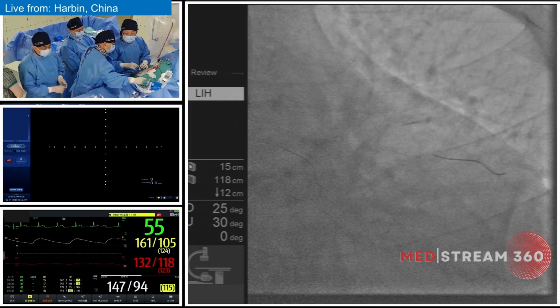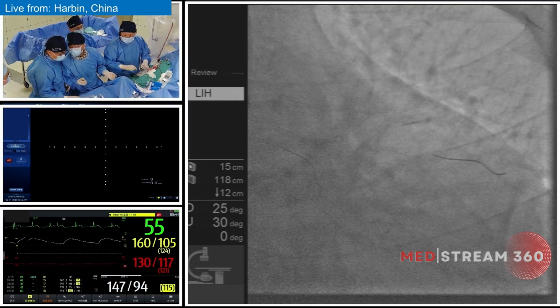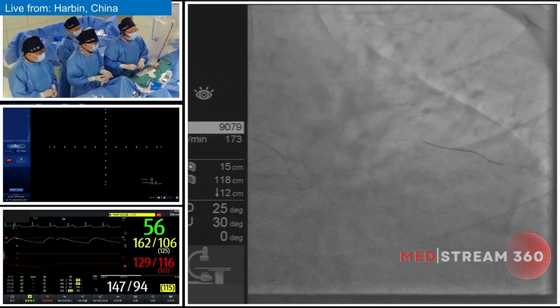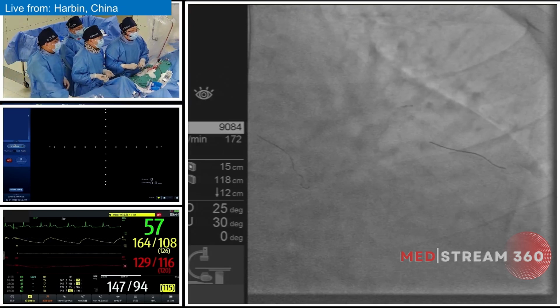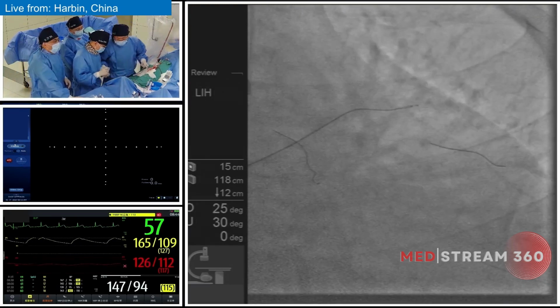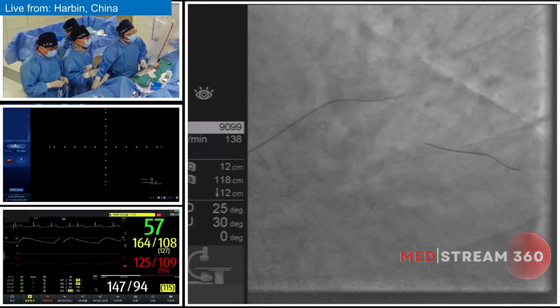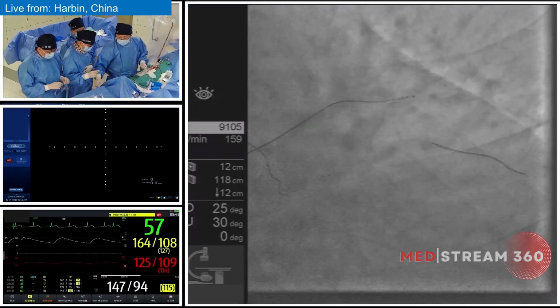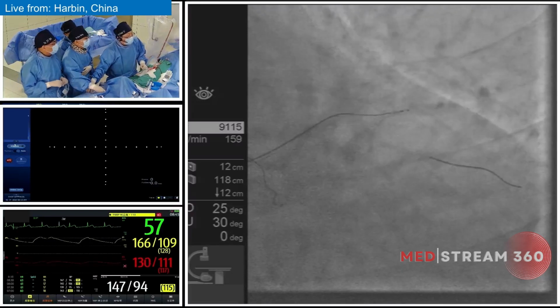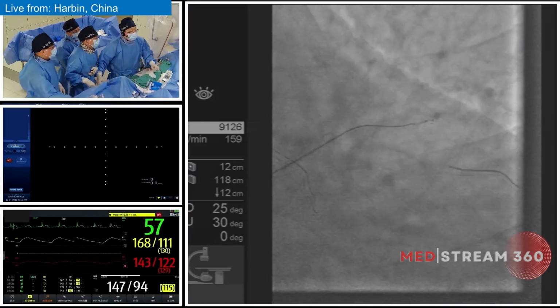New Pilot 200. So we are still using the Pilot 200 to try to puncture into the true lumen. And we should enlarge the picture and use this. Okay. So Professor Lee, do you think the calcification within the CTO segment is an issue for this puncture difficulty? Okay.